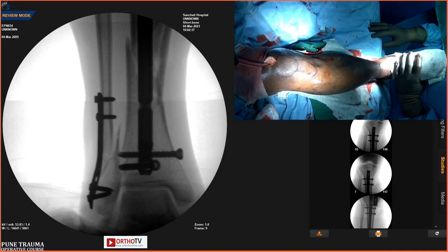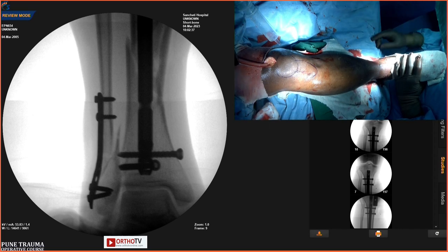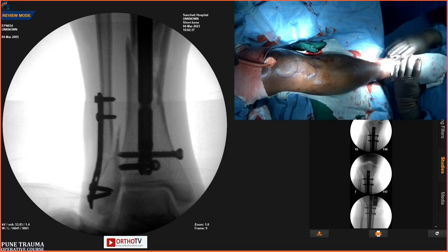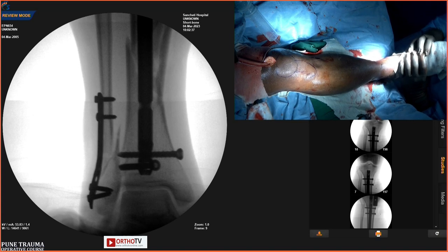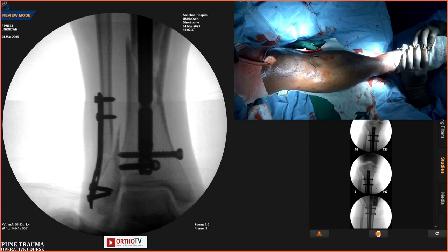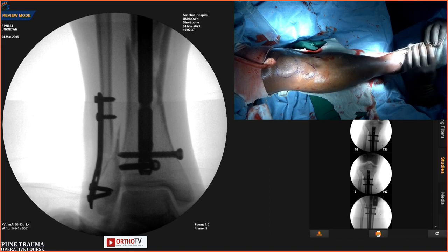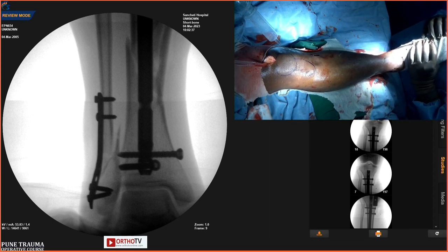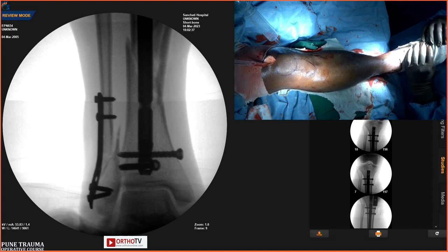Now the disadvantage of this nail, which you can see and appreciate, is that this screw hole is at the fracture site. This should not be there, so I have told him to change the design. Distally, that screw comes at the fracture site. It's not good for distal tibia. In spite of that, we have 3 screws in the distal fragment. Yes, 3 bolts. And you can see Chetan, this is the ETN design. You can go in the other direction also, locking the last screw. Yeah, we have gone in.